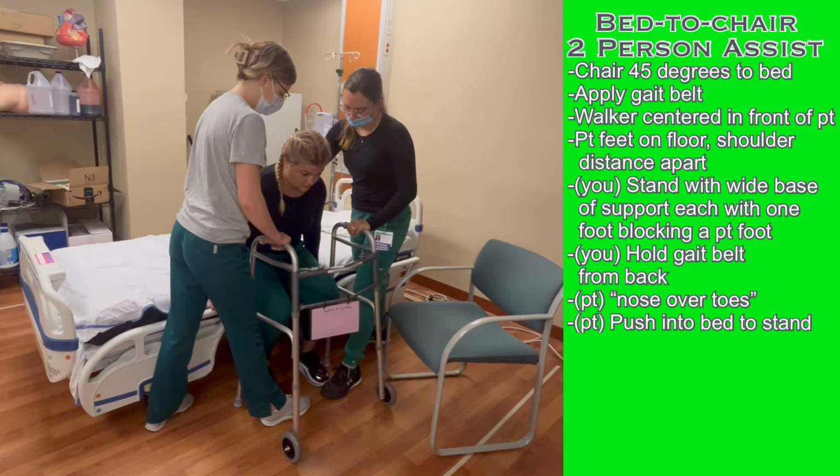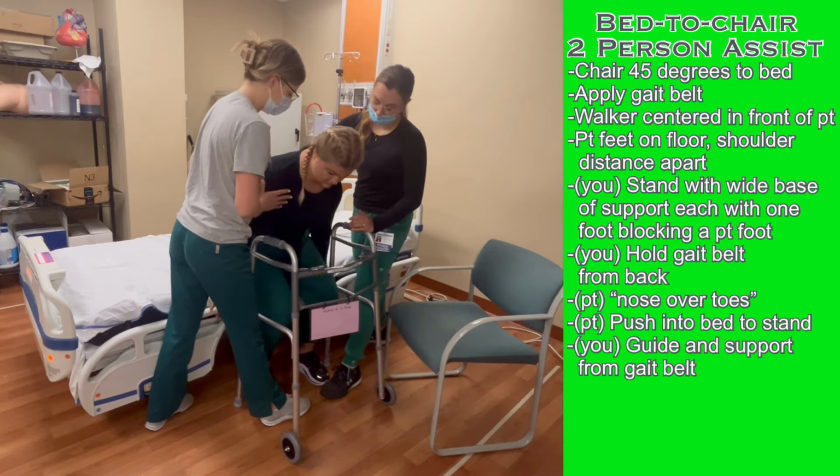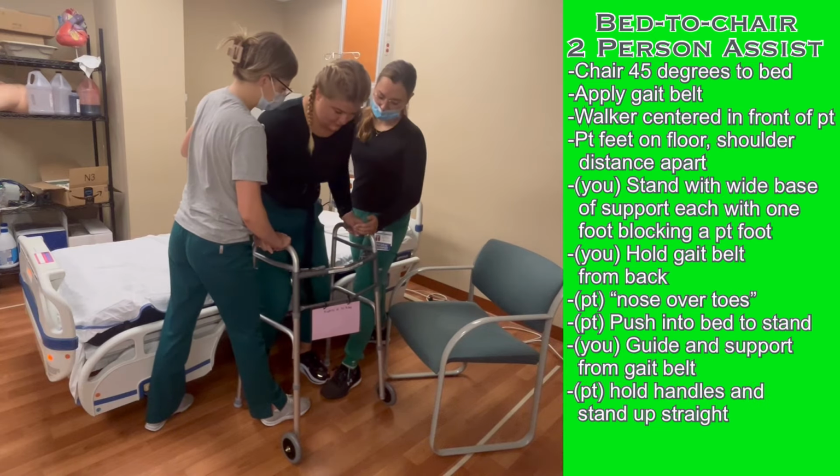Push into the bed and stand. You and your partner will assist the patient from the gait belt. Have the patient stand up straight.